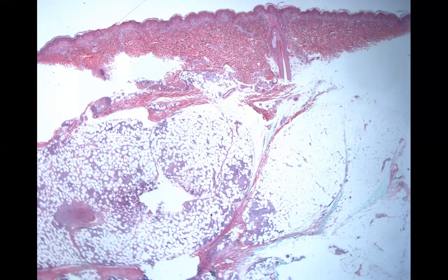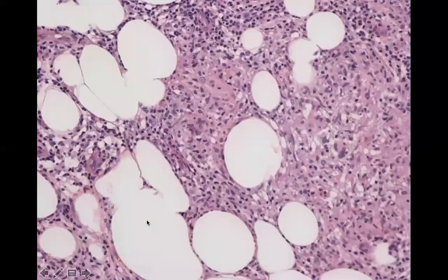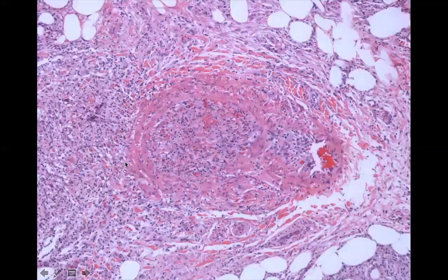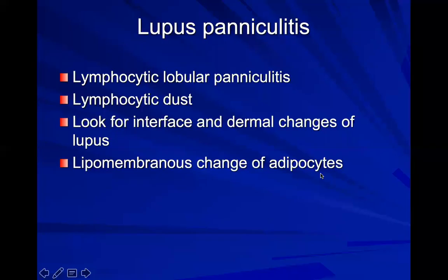Here's an example of nodular vasculitis. We can see again this prominent lobular panniculitis, and then we see fairly prominent vascular involvement. Up close, again, you have this granulomatous infiltrate, you have lymphocytes, maybe not so many neutrophils in this particular case, but then when you go in close, you can see obvious vascular involvement. Here's a little muscle-walled artery and some mixed inflammation surrounding it.